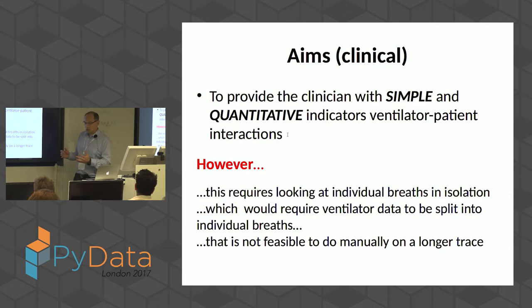Rather than creating these graphs with thousands of breaths cumulatively, we need to be able to split the trace into individual breaths, and it's not feasible to do that manually. You can look at a screen and identify one breath from the many visually, but it's not feasible on a trace of 12 hours with thousands of breaths. That's why I've become interested in this collaboration, and my computer programming colleagues are going to follow up on that. This is where I'm stopping, and I'm going to hand it over to Ian.